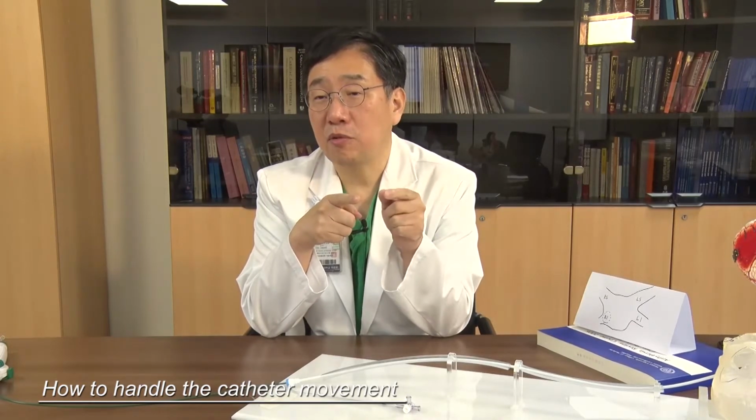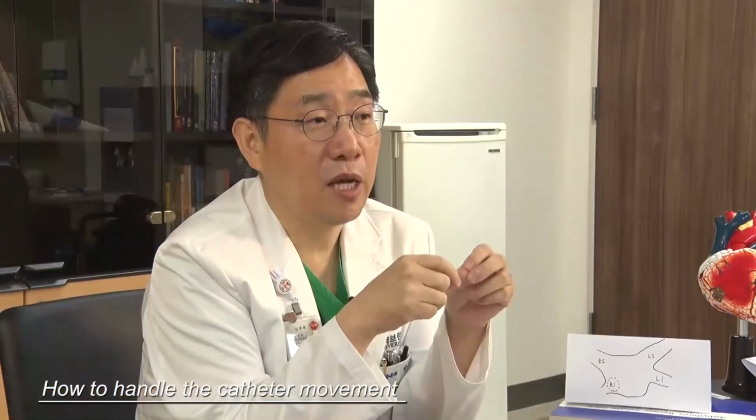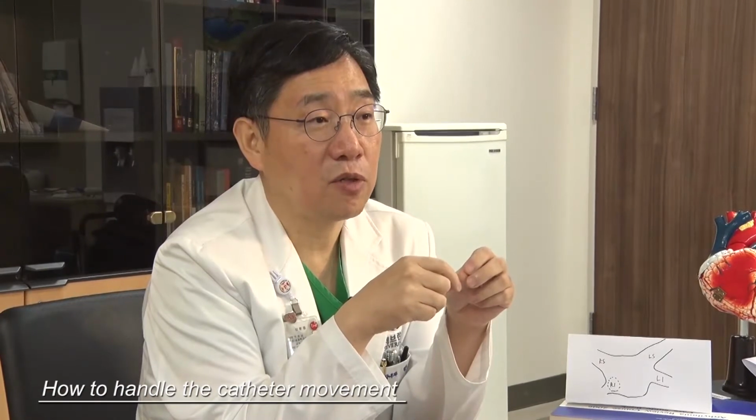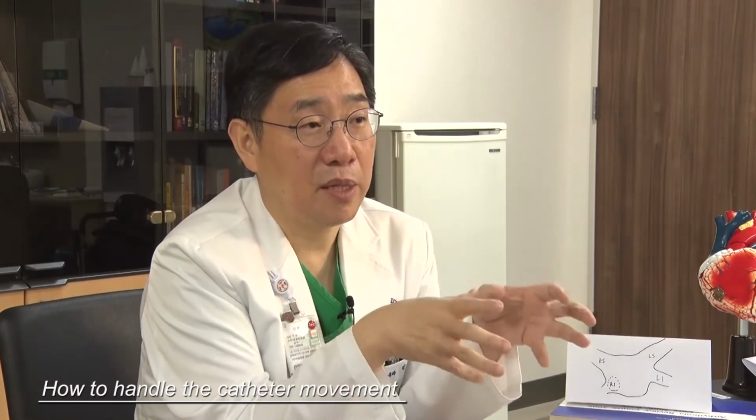And the second rule is you need to move the catheter very, very slowly. Generally, I recommend to my fellows to move the catheter 1 millimeter and wait 3 cardiac beats.